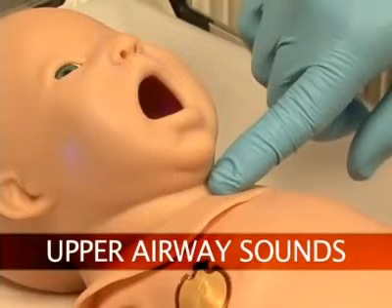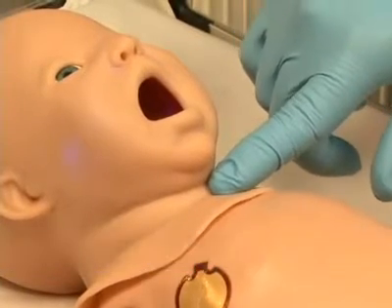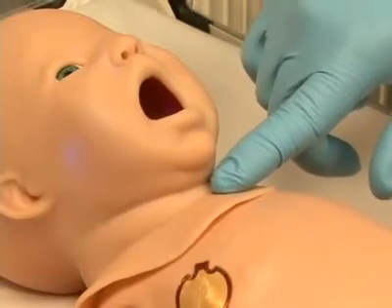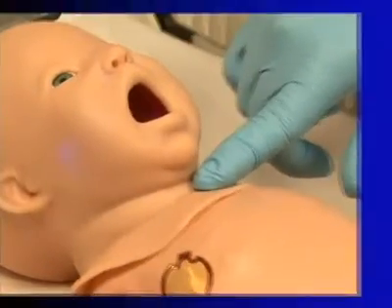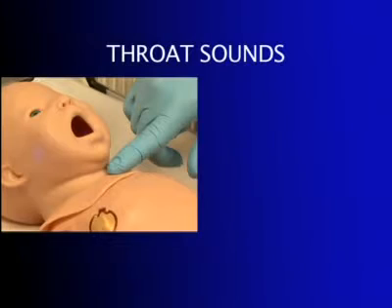Newborn HAL has several upper airway sounds synchronized with his breathing, such as normal breathing, grunting, or crying.